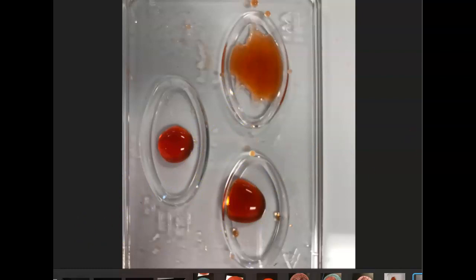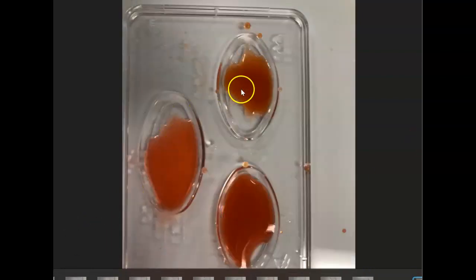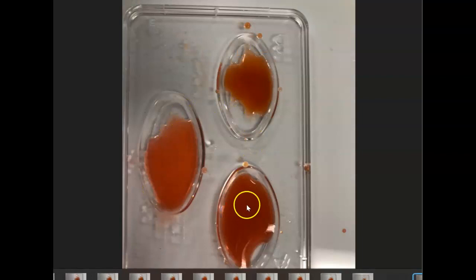And basically they mix them together. Now in this one, all three agglutinated. The B agglutinated, the A agglutinated, the Rh factor agglutinated. Again, it's upside down. I'm looking at what's written right there. So it would be AB positive.